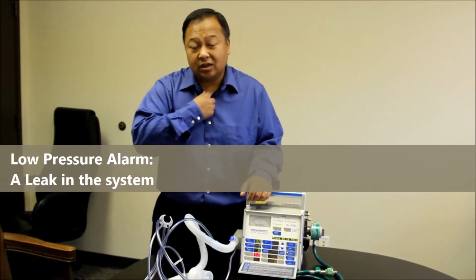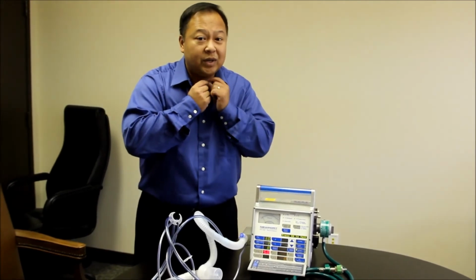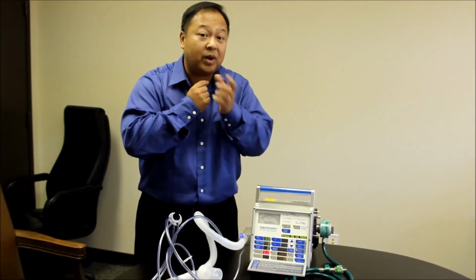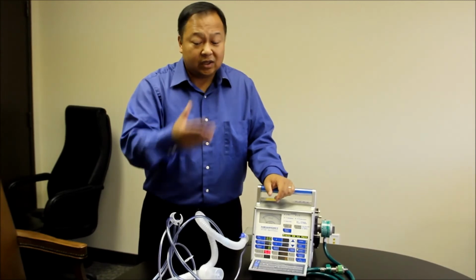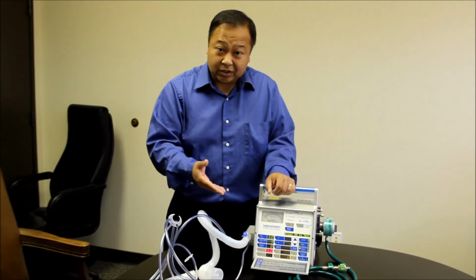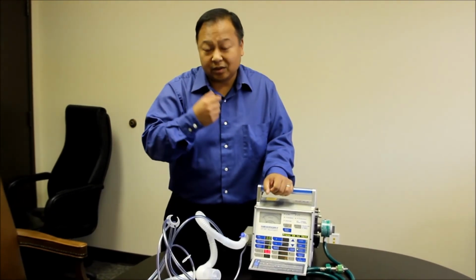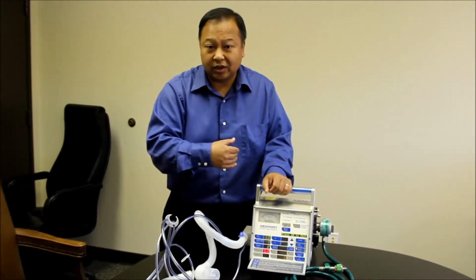If a patient has a trach, a lot of the times when the patient coughs or what have you, the pressure makes the circuit pop off, and when it pops off, it'll give you a low pressure alarm. So that's one of the causes. Look at your patient. If it's popped off, plug it back in. That'll fix the problem right away instead of hitting the silent button.